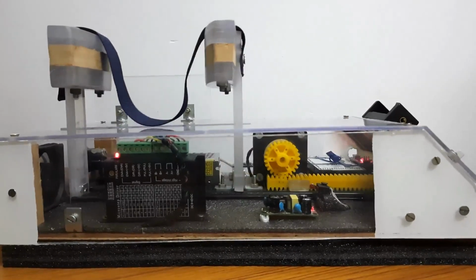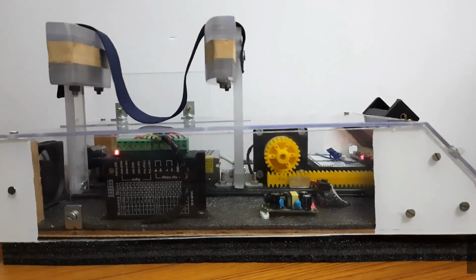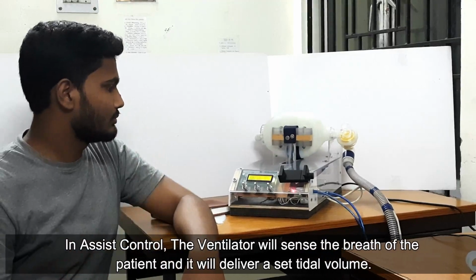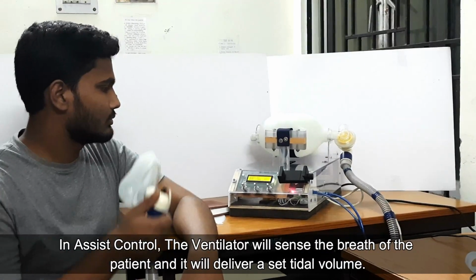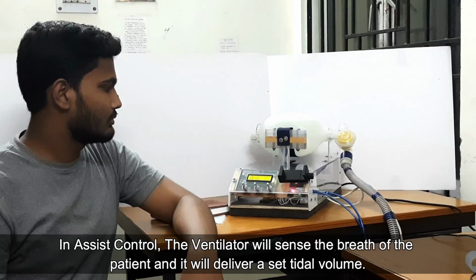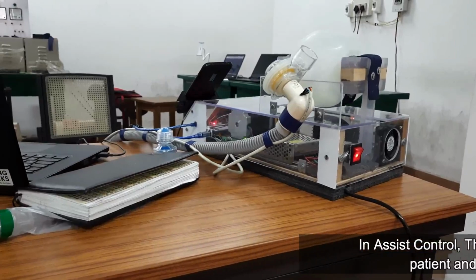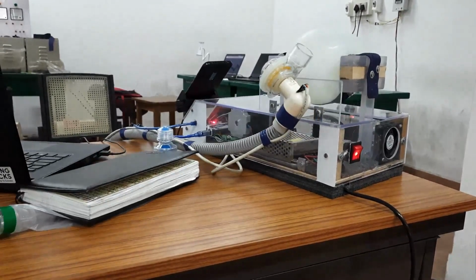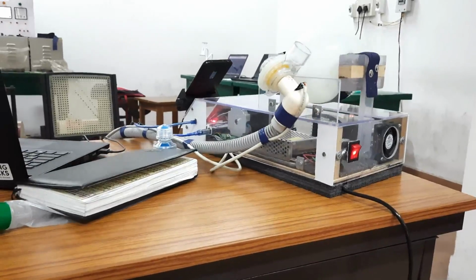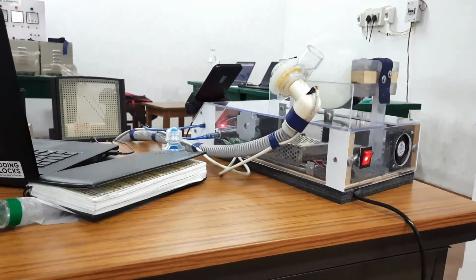There are two types of modes incorporated in our model: assist control and volume control. In assist control mode, the ventilator will deliver a fixed tidal volume at set intervals of time or when the patient initiates a breath. For this, two pressure sensors are attached to monitor the pressure, tidal volume and the flow. In volume control mode, the ventilator will deliver a breath with preset tidal volume and constant flow.